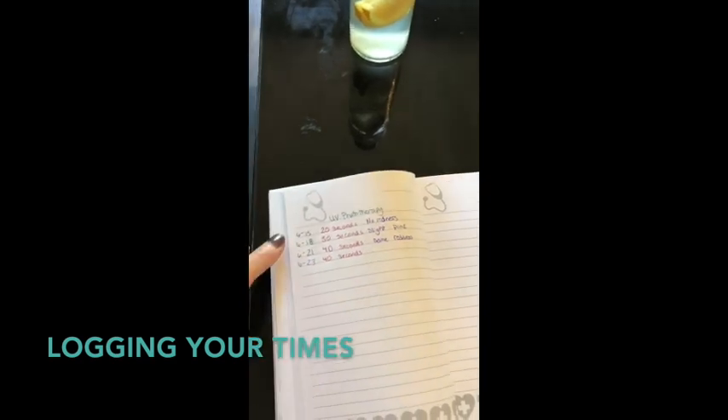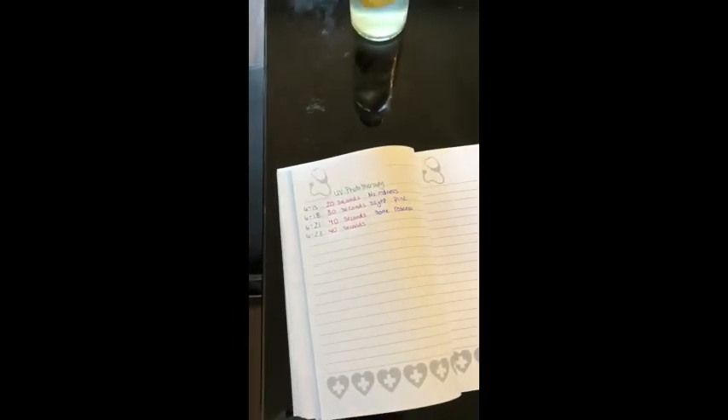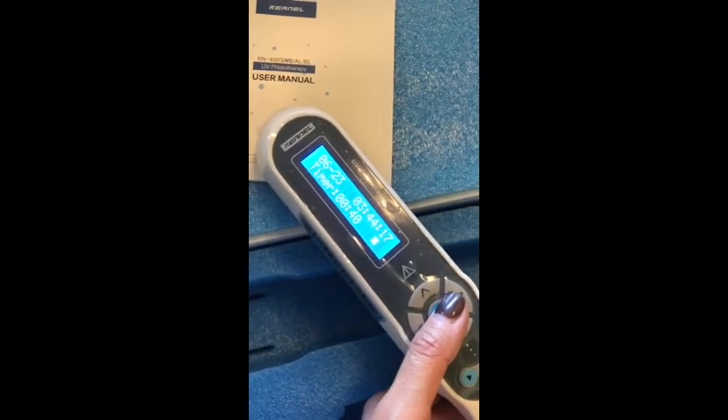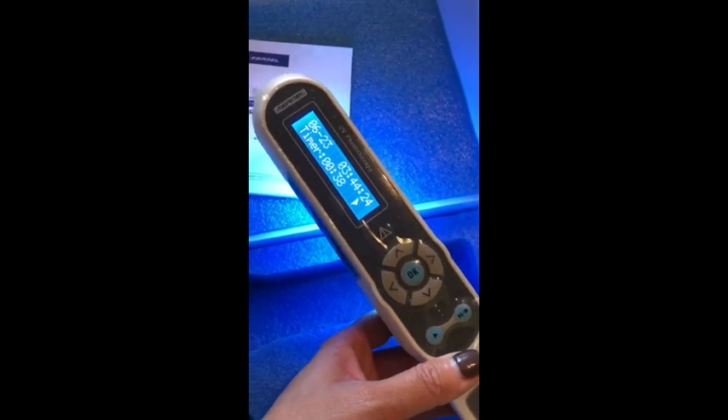I'm keeping a log of the actual time — the date, the time, and the side effects — so you can see I started at 20 seconds and had no redness, so I went up to 30 seconds and it was slightly pink, then up to 40 seconds where I had some redness, so I'm going to stay at 40 seconds. Everything is trial and error — you have to see what works for you. When you turn it on, you can set your timer; I have it at 40 seconds already, so I'll leave it. You just push the power button and it comes on pretty easily.